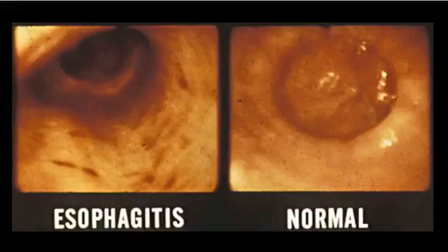So here is the endoscopic impression, the normal esophagus on the right, and an eroded, inflamed looking one on the left, and they have their LA classification scheme for how bad that is based on whether it's circumferential and how many centimeters are involved.